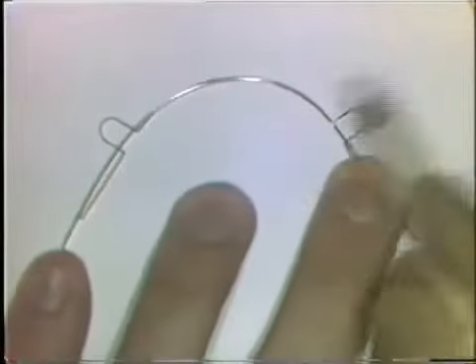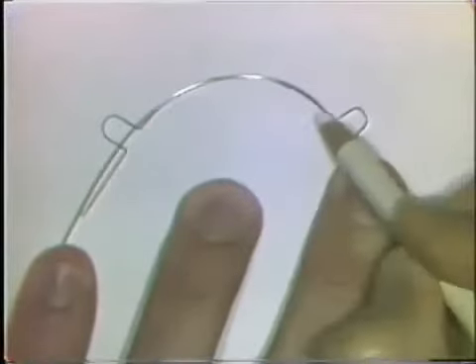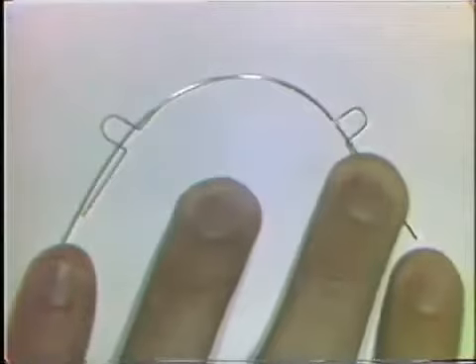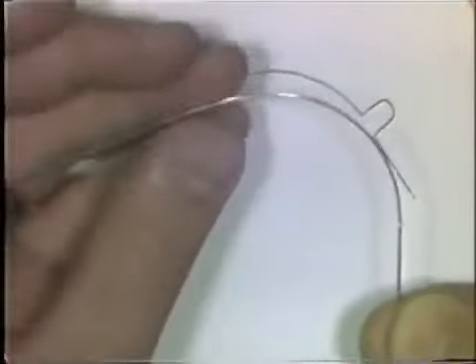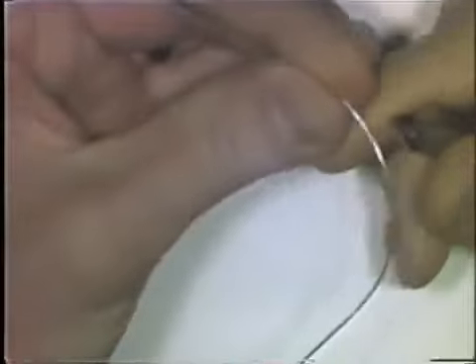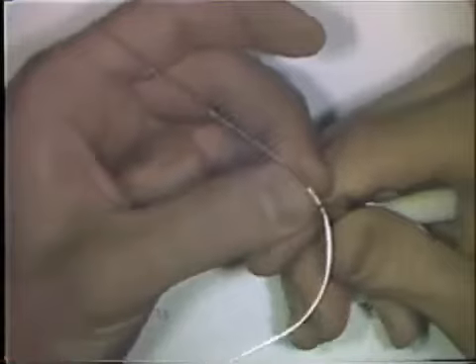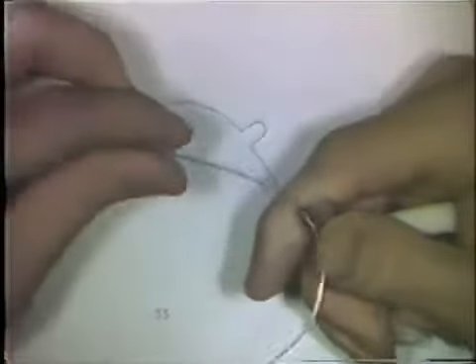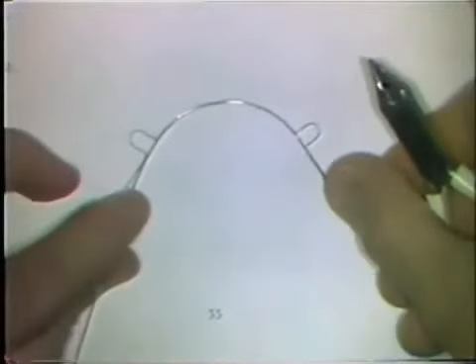Now, I've completed most of the curve except for the last section to show you the method you use to adapt this curve. You adapt it along until it reaches a point where it begins to leave the pattern, and that's where you make a little mark on the wire. What you'll find is that the place where you've made the mark is probably an overly flattened area, and you make a series of small bends in the wire on either side of the mark that you've made and directly over the mark, and this adapts it then to this exercise pattern outline.